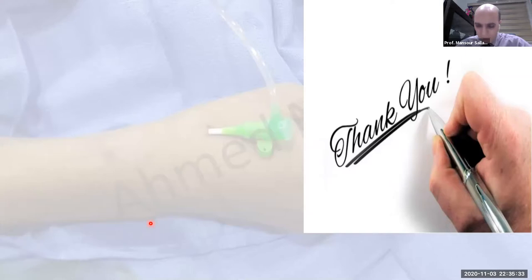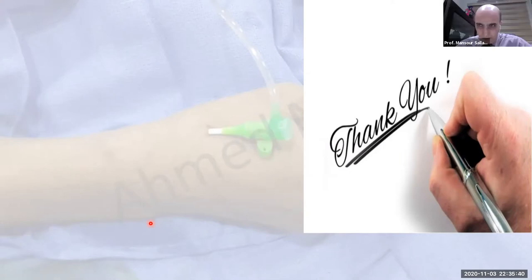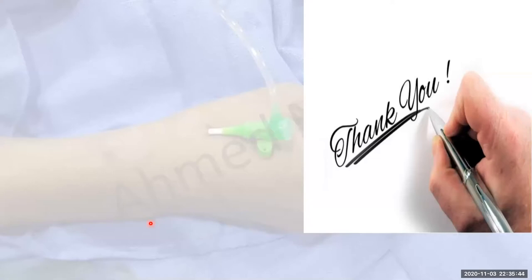The matter is restoring TIMI 3 flow. Right. Again, as I mentioned, the patient went into arrest for around 20 minutes, and at that time there is no chance to repeat the ECG, to do serial ECGs for that patient. So we depend on the presenting ECG. Maybe there were other ECG changes which we didn't notice because of the critical situation, but this is the presenting ECG for him.